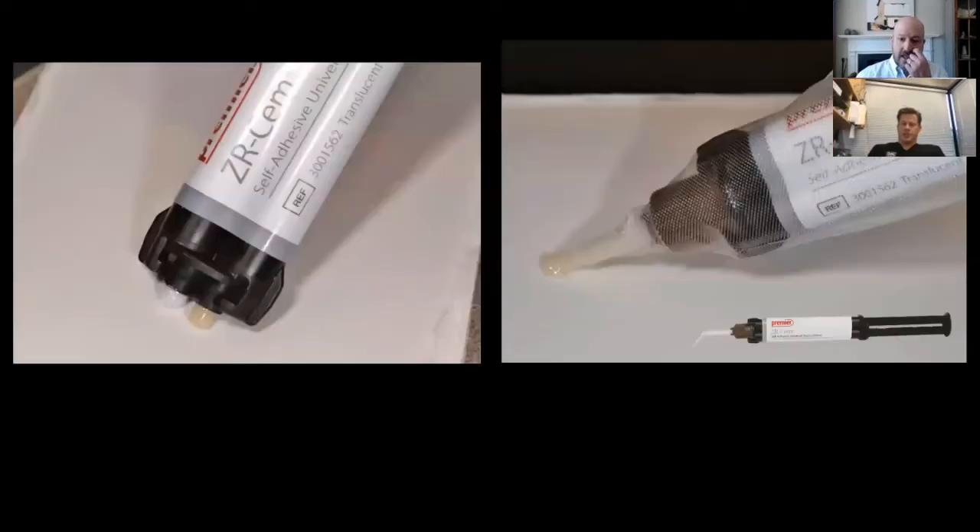This is the ZR-cem cement I sent you. It's a self-adhesive resin cement, and the trick with these dual-barrel syringes is always to bleed twice — once through the syringe and then through the tip. I also like that you used a barrier sleeve here — it's called Sleeve-It. When you think about self-adhesive resin cements, is there something about that category you like, or is it more of a universal one-stop that you can use for everything?